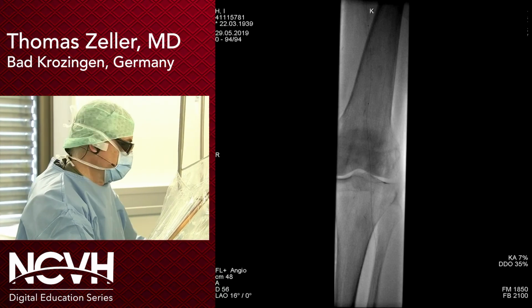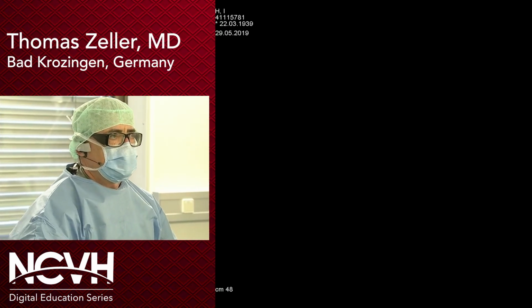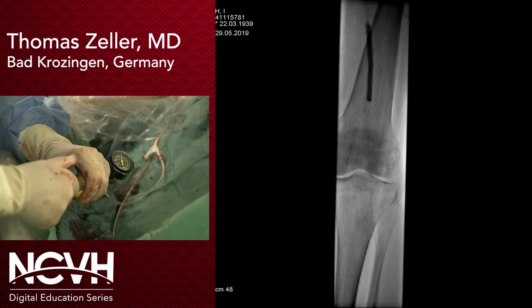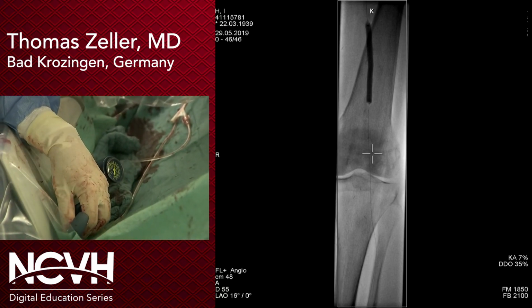It's probably something for a second intervention in the near future. But I believe if I could achieve a good result with the drug-coated balloon in the anterior tibial, then it should be fine for the lady to resolve her rest pain.